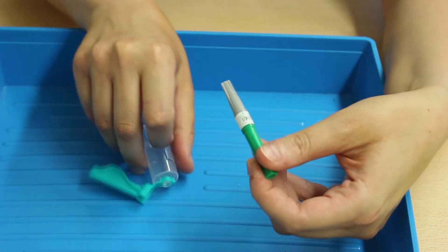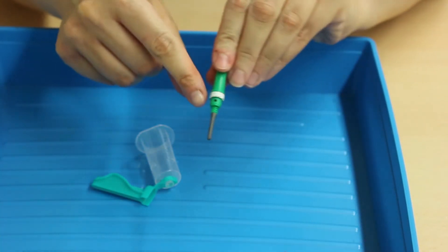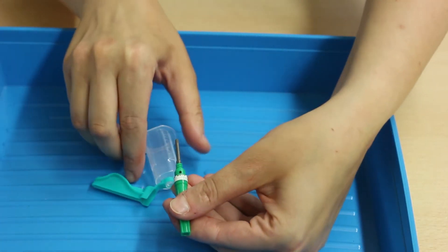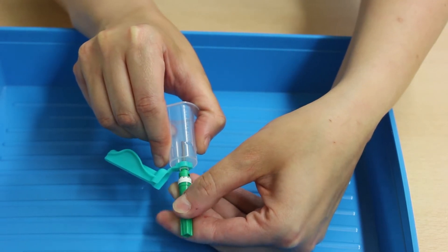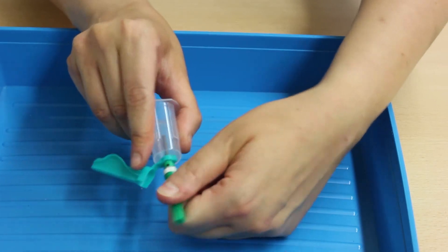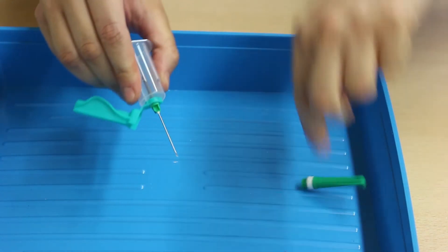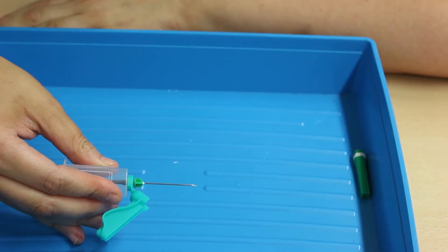Insert the needle into the holder and rotate it clockwise until it meets at the center. Once assembled, the bevel of the needle should be upright. I've entered the patient zone, decontaminated my hands, and I'm going to put on my gloves, then prepare my equipment.